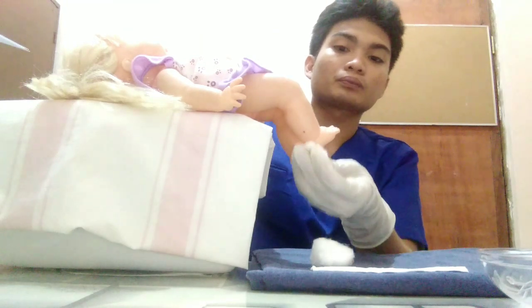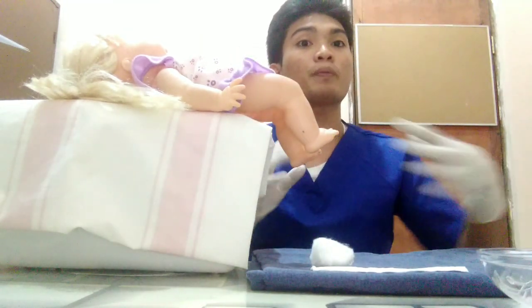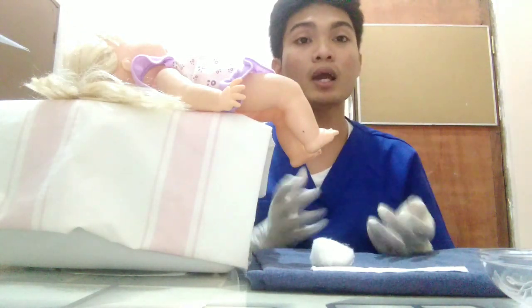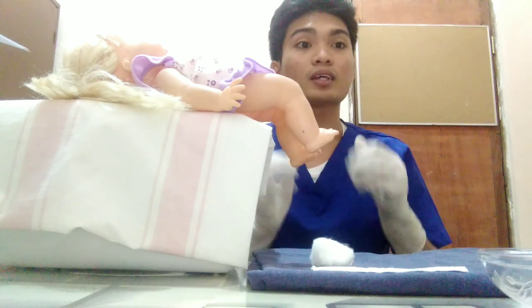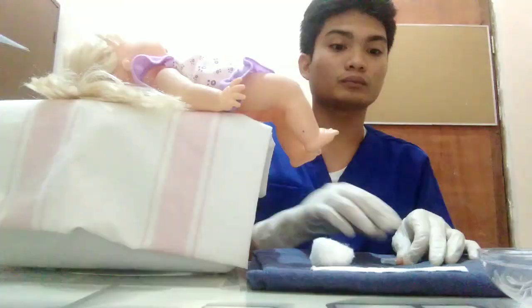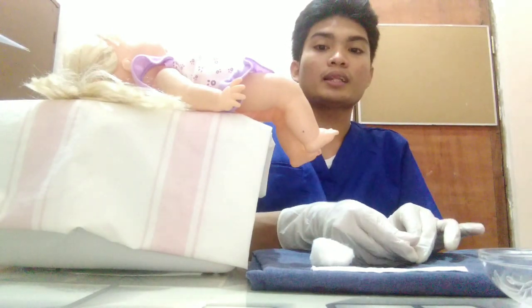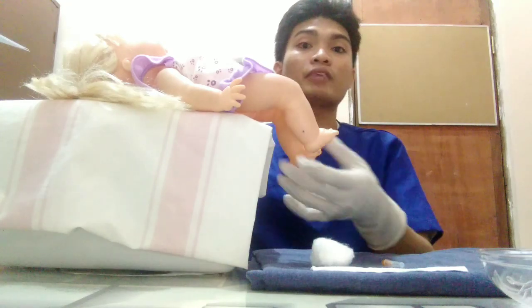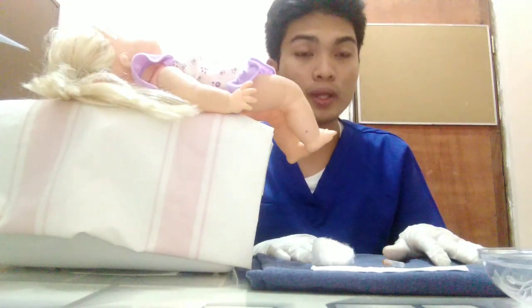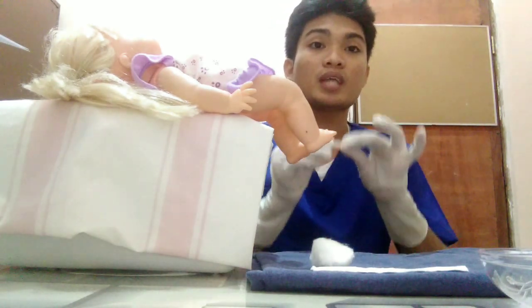Okay, so now let us assume that the 3 minutes is over and we've already warmed the surface of the heel of the baby. We will be letting it dry. Okay, now let us assume that the feet of the baby was already dry. What we will be doing now is we will be pricking the heel of the baby using a needle.